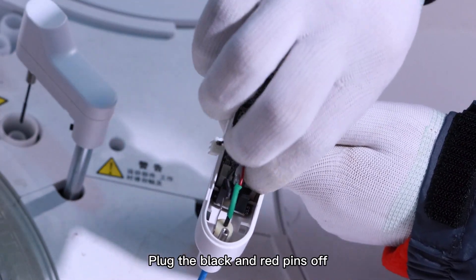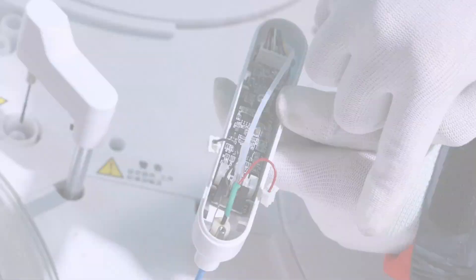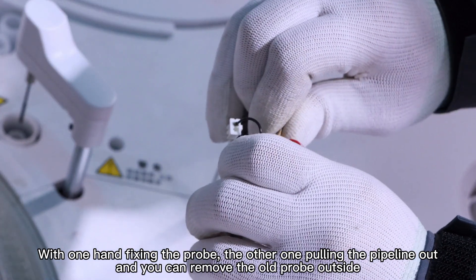Plug the black and red pins off. With one hand fixing the probe, use the other one to pull the pipeline out, and you can remove the old probe.